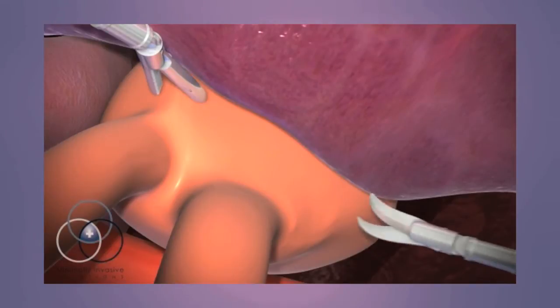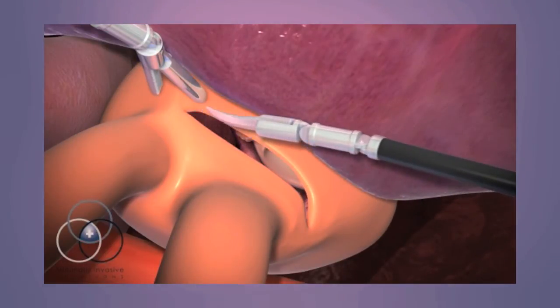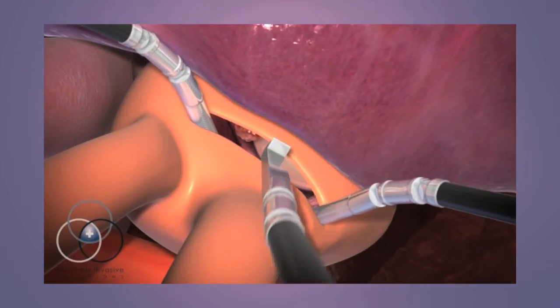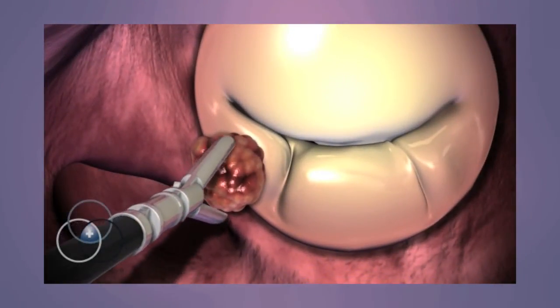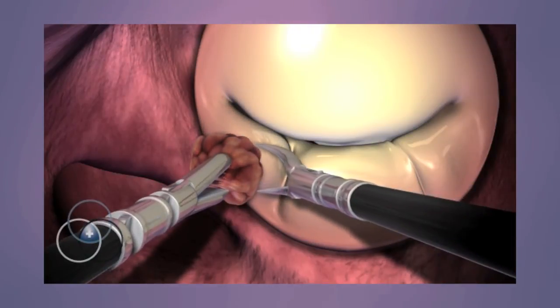Once the heart has been stopped, the surgeon creates an opening in the atrium to gain access to the tumor. Using the third instrument arm, the surgeon lifts the roof of the atrium, exposing the tumor. The surgeon quickly and carefully removes the tumor.